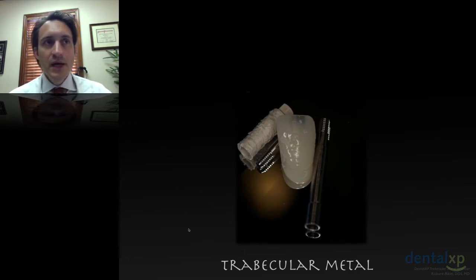You can also see this is the peak abutment. I have roughened the surface. My assistant will roughen the surface as well, and we will treat this with binding agent. Also, we have the short provisional abutment screw and the long abutment screw.